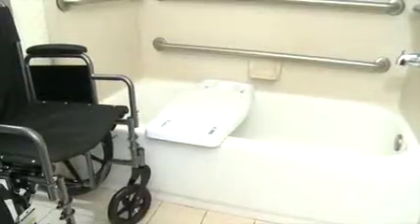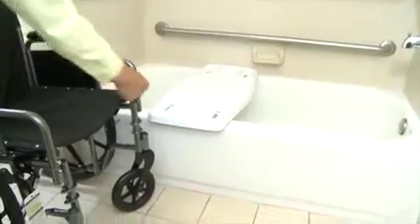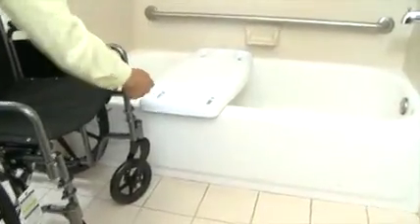Step 1. When using a wheelchair and the person is able to stand, position the wheelchair parallel to the tub just behind the bathing board. The front corner of the wheelchair and the rear corner of the bathing board should be touching, allowing room for the individual to stand and turn. Lock the wheelchair brakes and swivel the front wheels out of the way to a rear-facing position.